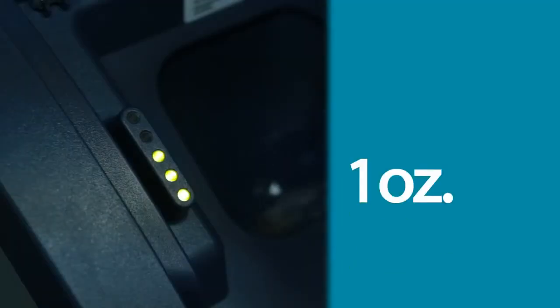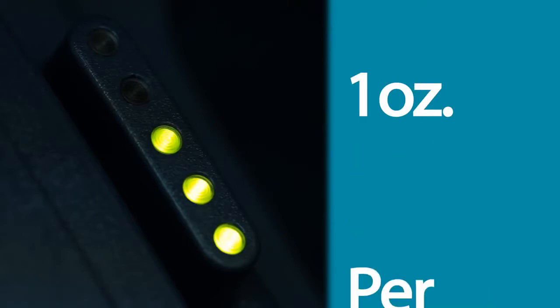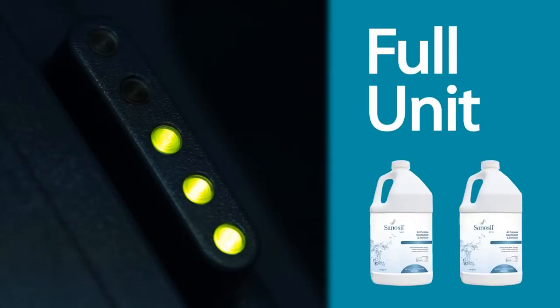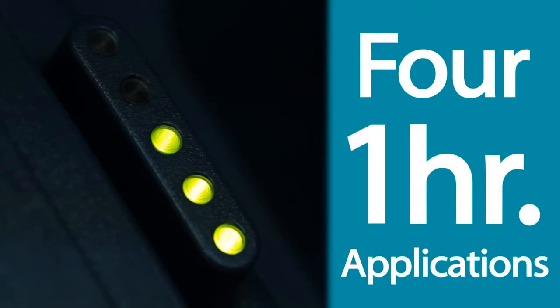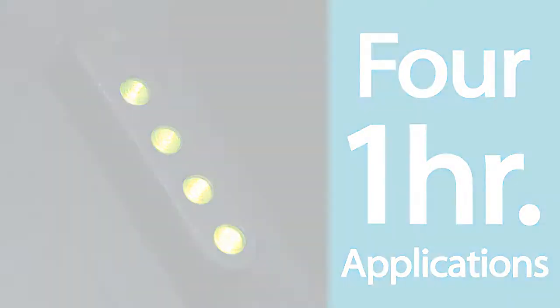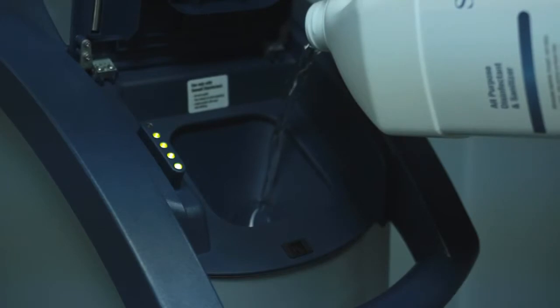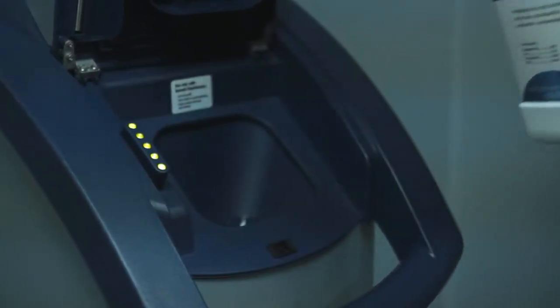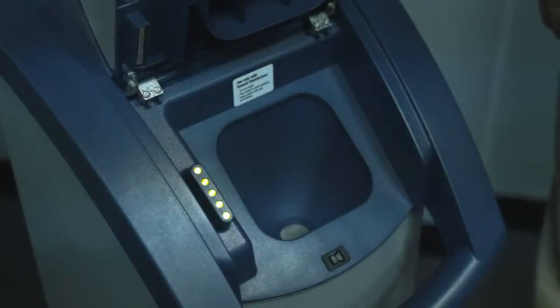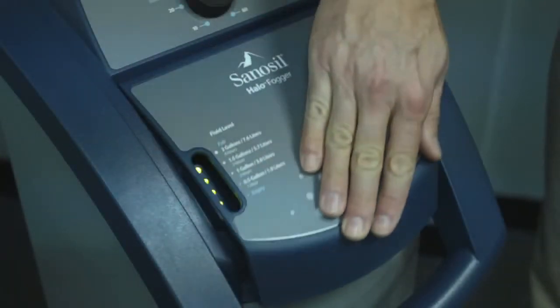In operation, the Halo dispenses approximately one ounce of Sanosil per minute and holds up to two gallons of disinfectant when full, enough for four one-hour applications. Stop pouring when the top green light on the fluid indicator is illuminated. Do not overfill. Wipe up any spills and close the reservoir door, ensuring it clicks shut.